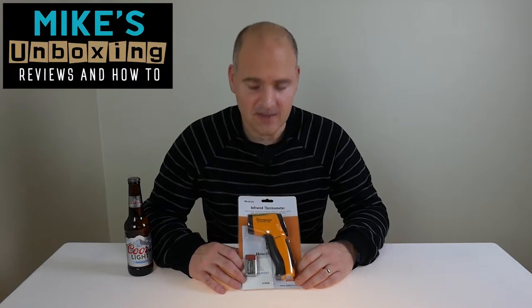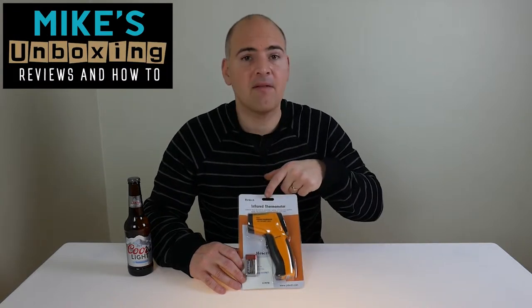Hi, this is Mike from Mike's Unboxing Reviews and How-To, and today we're going to take a look at the Helect Infrared Thermometer.